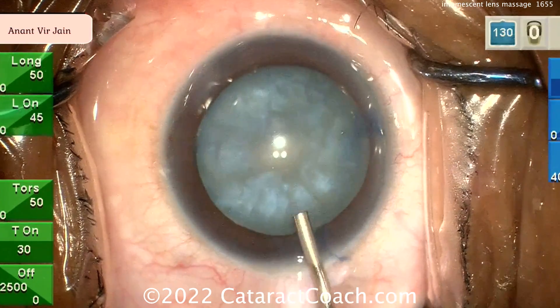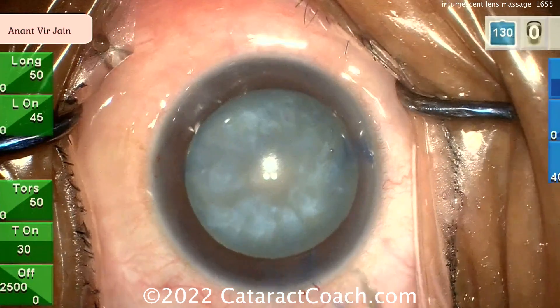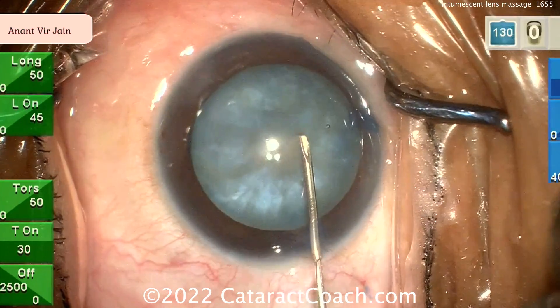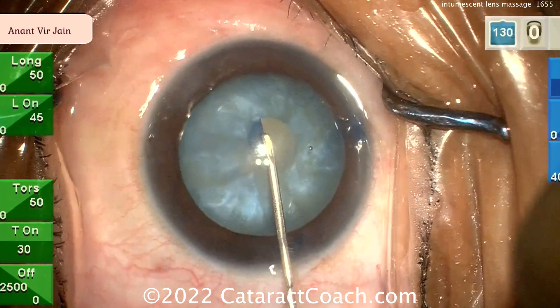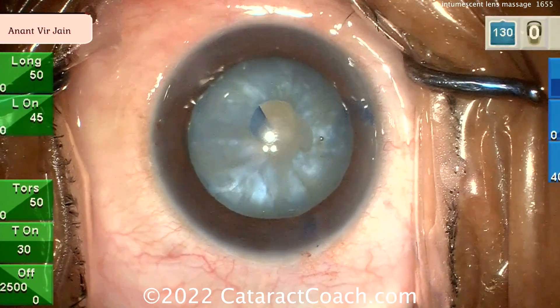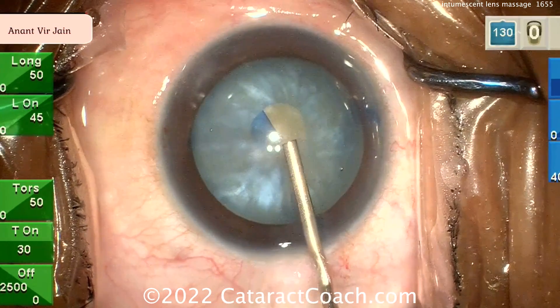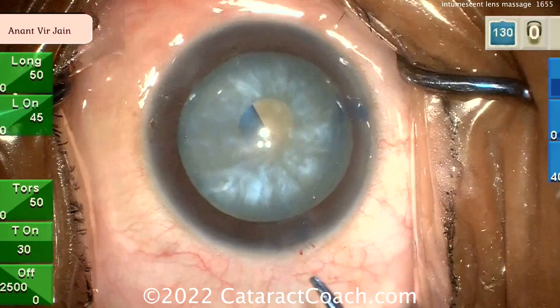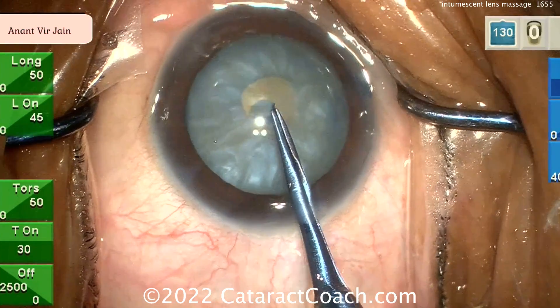Going inside here with more viscoelastic, and now needle decompression. Starting the rexus — looks like there's a little milk coming out. Double rexus technique — I like a baby rexus. Double rexus is a great idea: make one small rexus right off the bat quickly so that you have a nice, round, intact opening so it's not going to run out. Now you can really decompress.